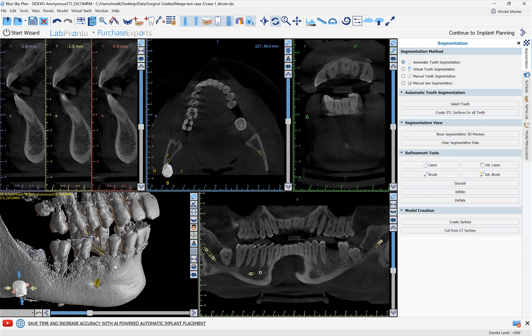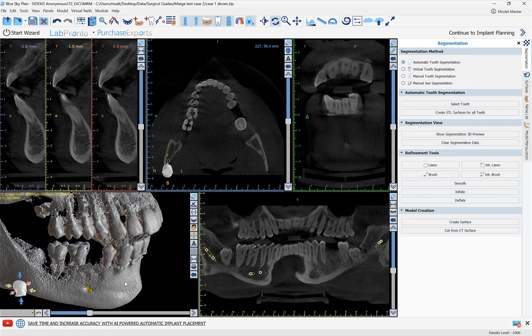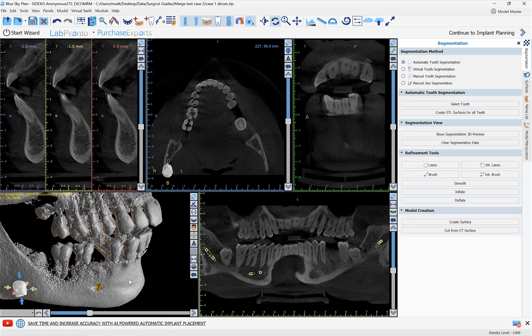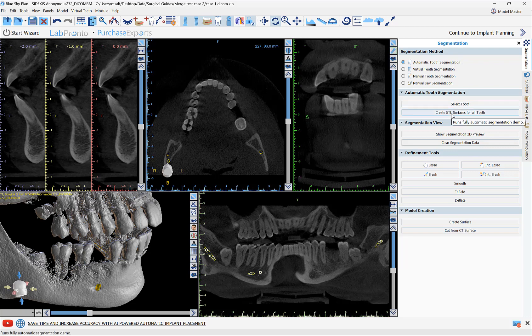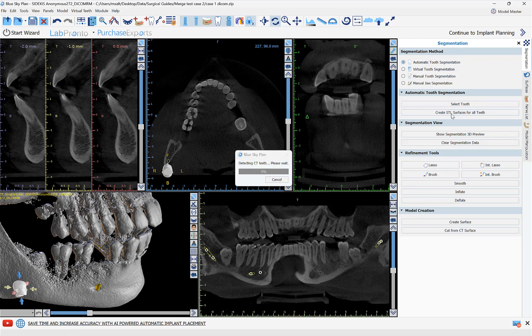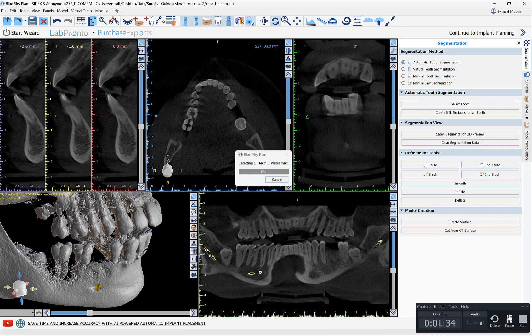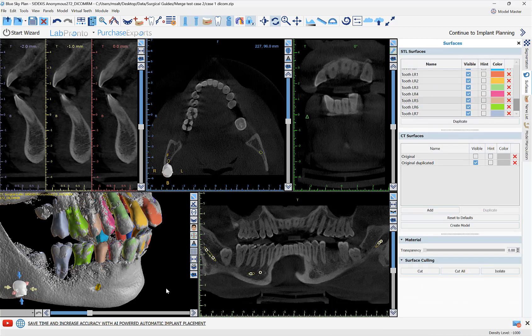We can now see the 3D CT view without the tooth that we just removed. If we do want to go ahead and segment all of our teeth with the click of a button, we can go to automatic tooth segmentation and create STL surfaces for all teeth. This will take a minute to run.